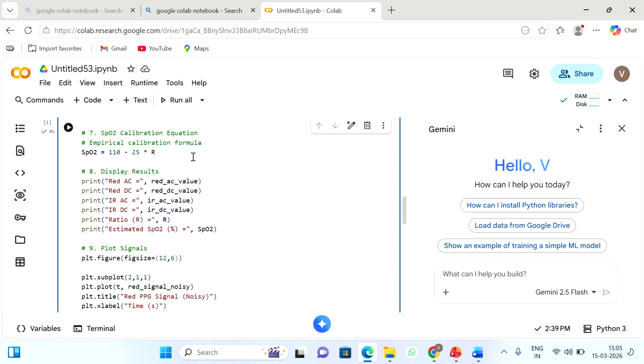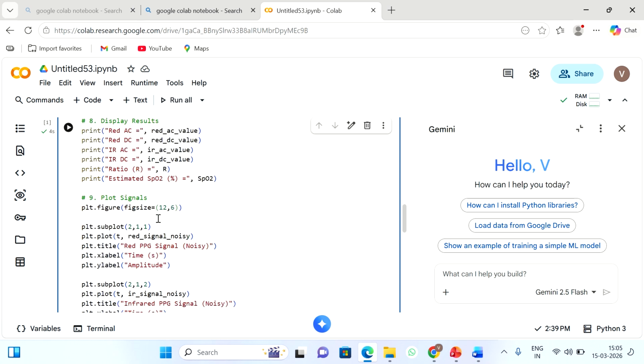So we have to display the results. What are the values we determined? AC value for red, DC value for red, AC value of IR, DC value of IR, and R using the formula we have calculated. From this we calculate the estimated value of oxygen SpO2 using this formula. Finally, we have to plot these in the graph.